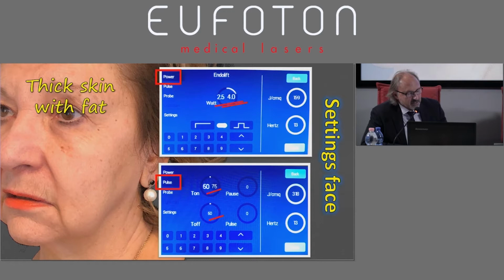We want to get some clinical evidence of good results, but that's subjective. You have patients at 200 joules for one side where I see good results and then stop. For other patients, it takes more time to get good results. Now we have to be more clever in making a good setting of this method, this technique.